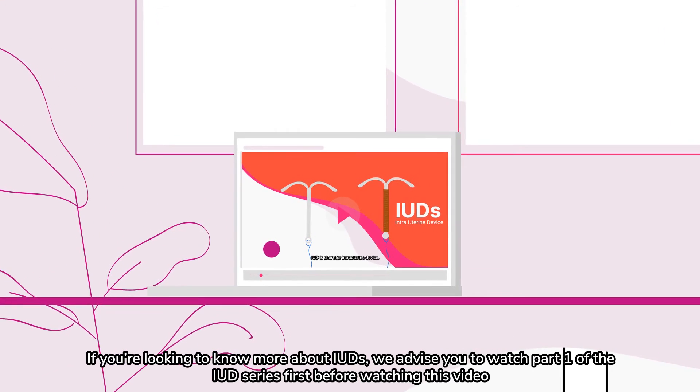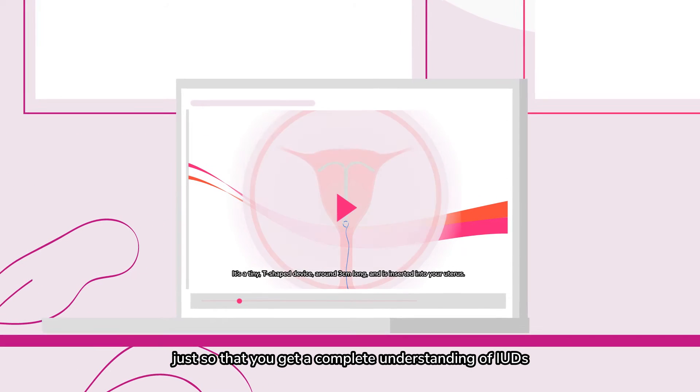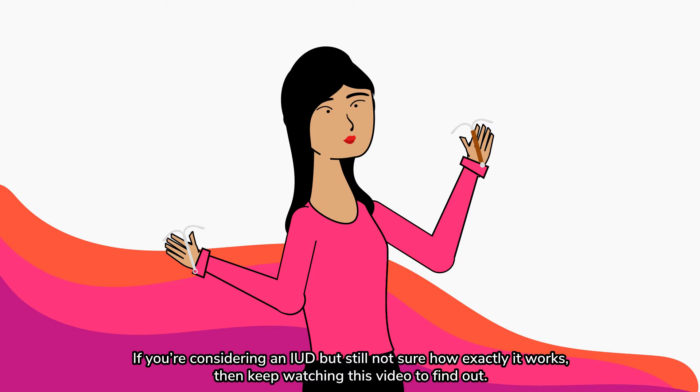If you're looking to know more about IUDs, we advise you to watch part one of the IUD series first before watching this video, just so that you get a complete understanding of IUDs. If you're considering an IUD but still not sure how exactly it works, then keep watching this video to find out.